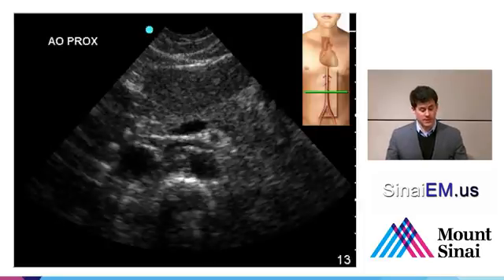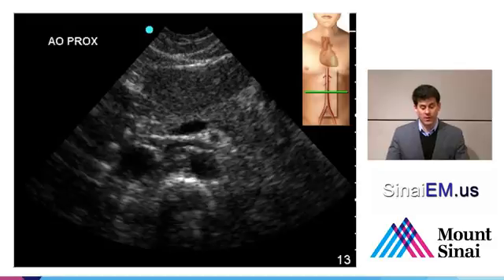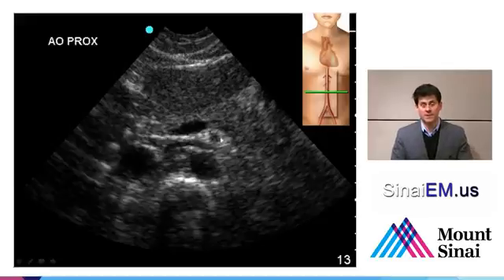So what do these images look like? Well, again, we see the anatomy that was described before in this proximal view of the aorta. We see the liver in the near field here and curving around towards the screen left. We see the superior mesenteric artery here surrounded by a bit of a rim of fat, which makes it light up, and that brightness can highlight it. Just below that, we see the abdominal aorta. To the patient's right, to your screen left, we see the inferior vena cava. And here we have the vertebral body down below as well.